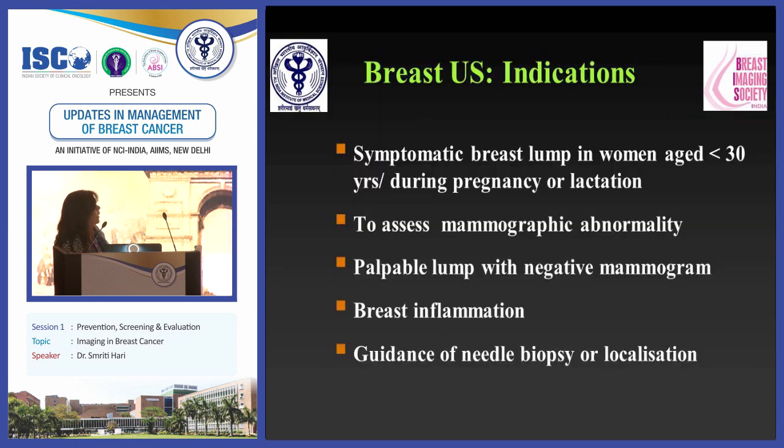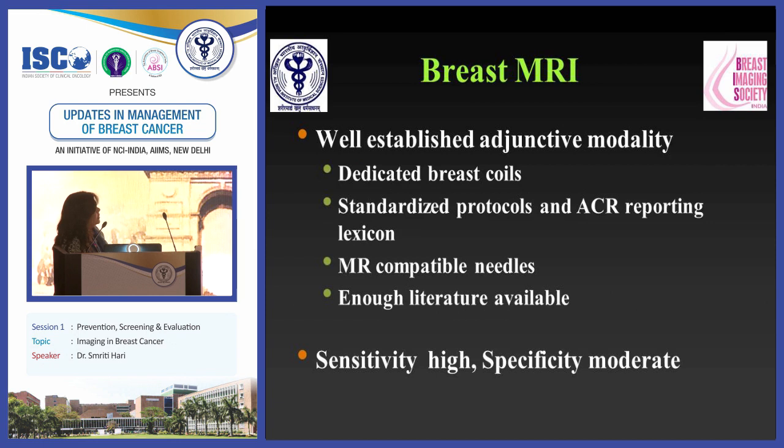Breast ultrasound has indications, especially in women less than 30 years. It should be the first investigation, and in women during pregnancy or lactation. Otherwise, it can be used to assess a mammographic abnormality, for breast inflammation, and of course to guide the needles for biopsy or localization.